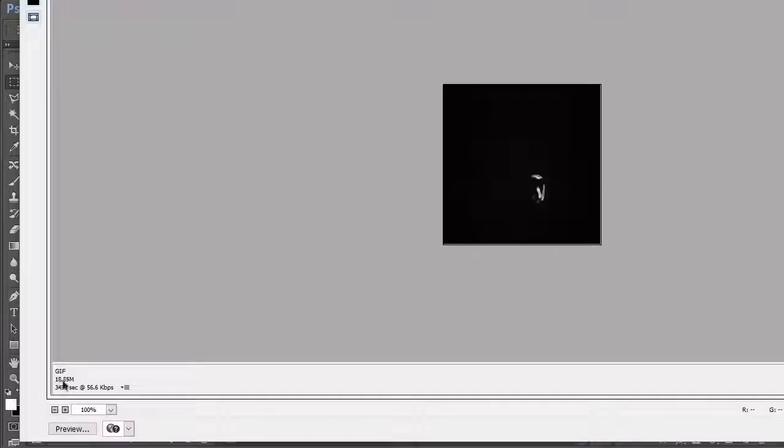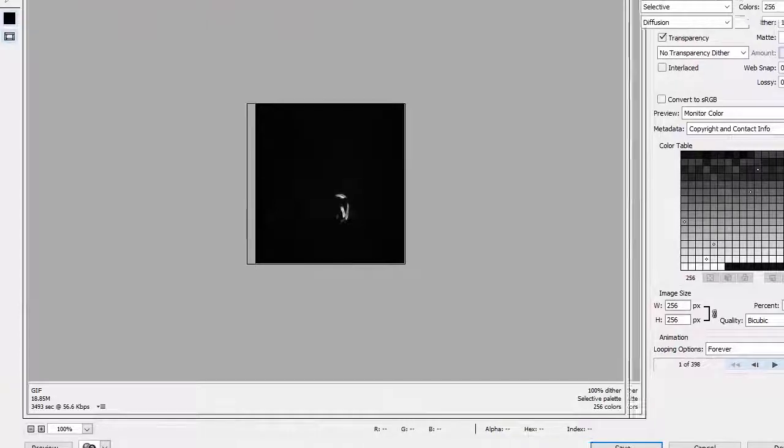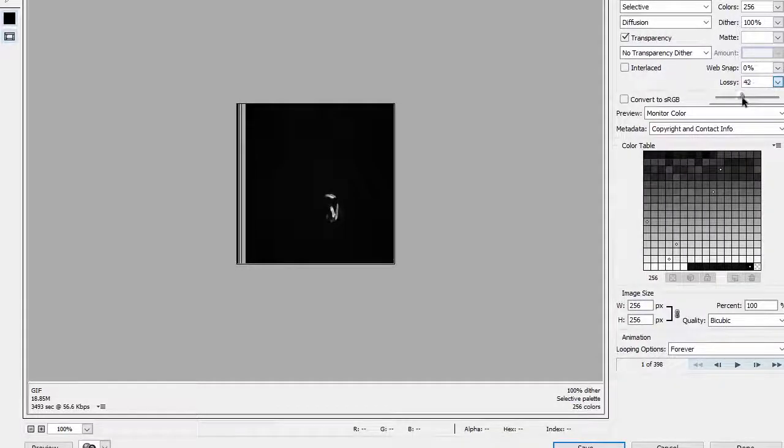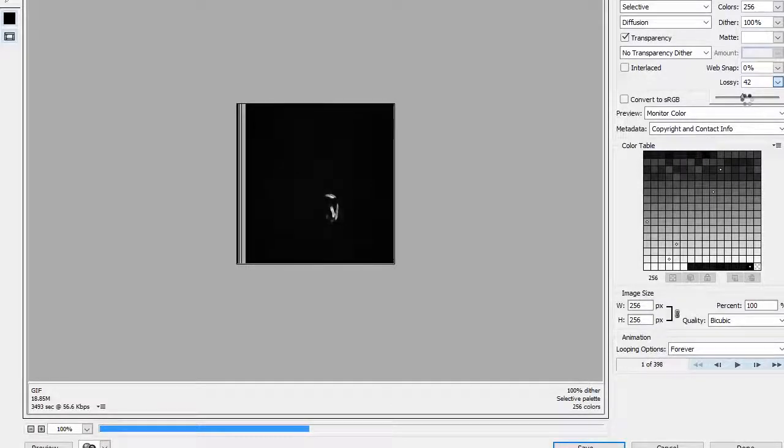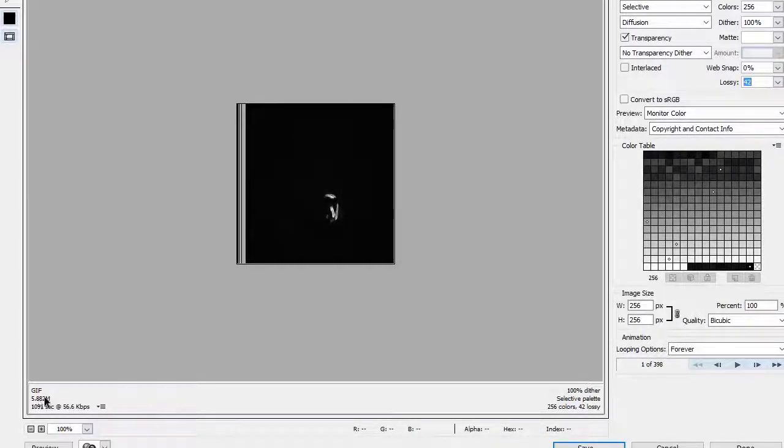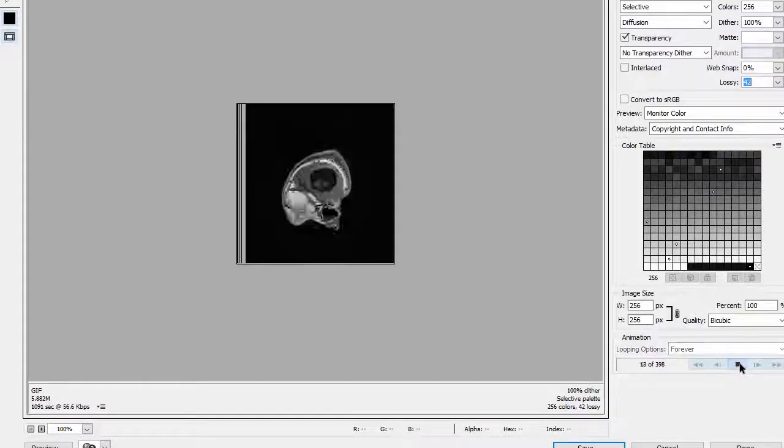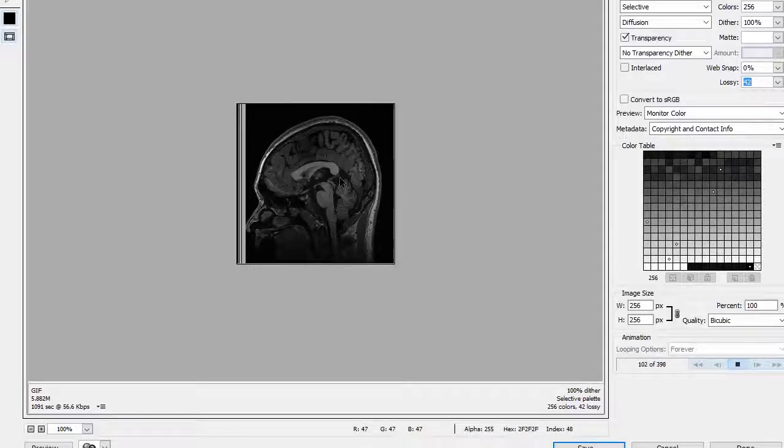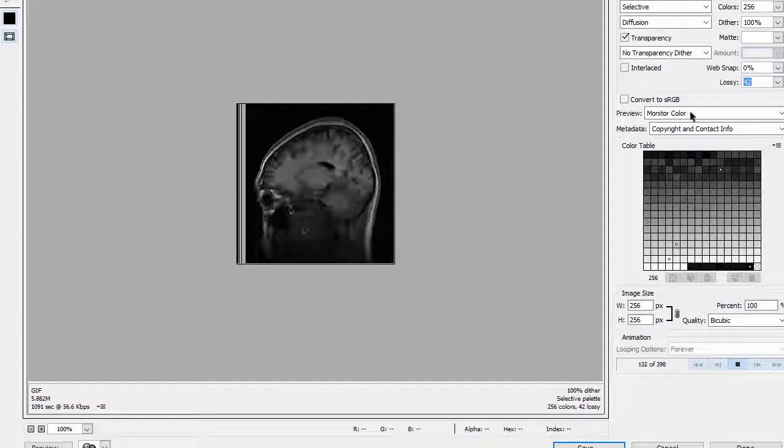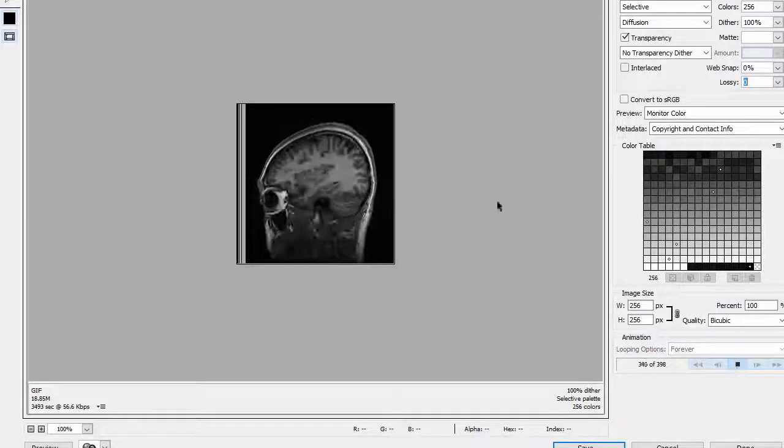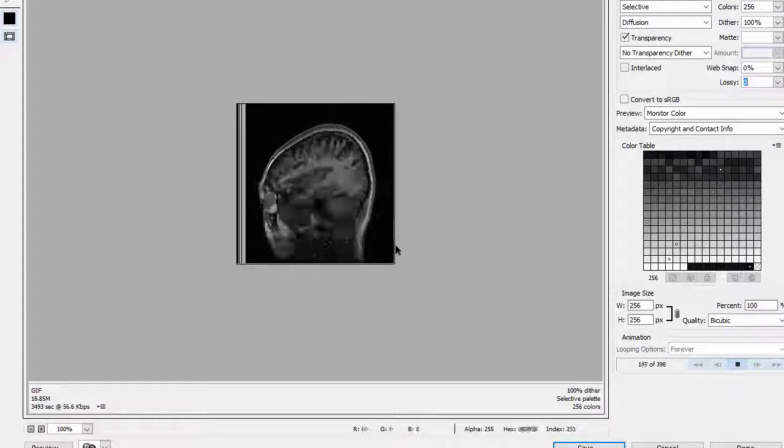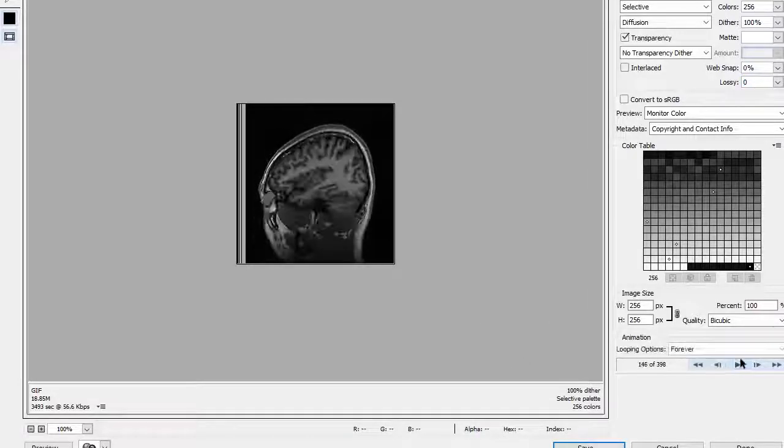We want to make sure that GIF is selected from this drop-down. You'll see here that this file is going to be 18 megabytes, which is pretty big. So if you wanted to make it a little smaller, you could make it lossy—you're going to be sacrificing image quality here for file size. At about 42%, our file size has gone down to 5.88 megabytes. But if I play the image, it's also super duper fast and it is a little grainy. I don't know if you wanted to put it online or something, maybe you could live with this. If I reduce the lossiness down to zero, we go back up to 18 megabytes. It's probably hard to tell here but I can assure you it is less grainy.